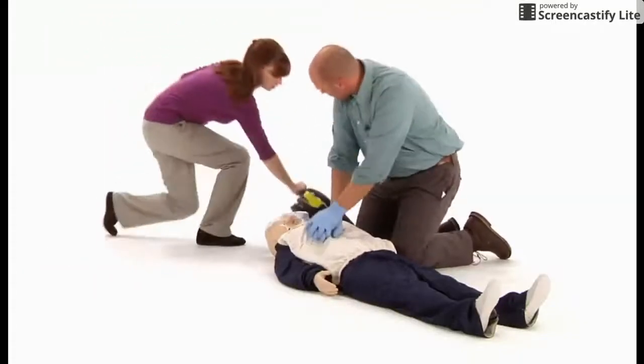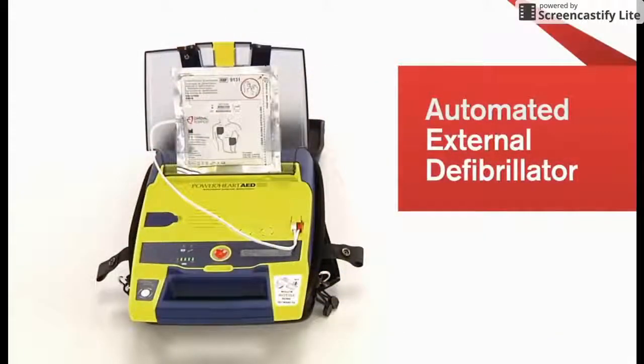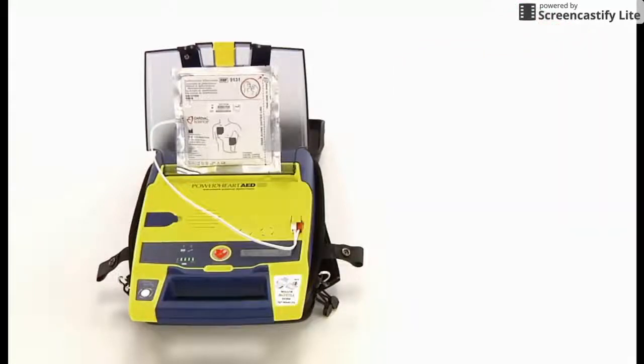12, 13, 14, 15. An AED, or Automated External Defibrillator, is a portable electronic device that analyzes the heart's rhythm and determines if an electrical shock is needed to help the heart restore an effective rhythm. Most AEDs can be operated by following these general instructions.